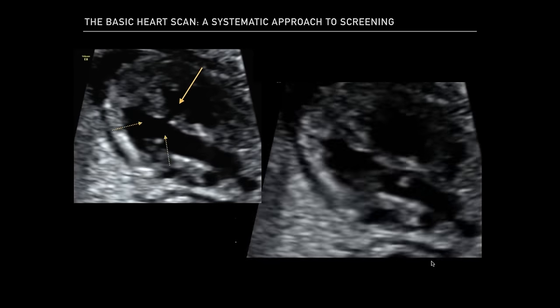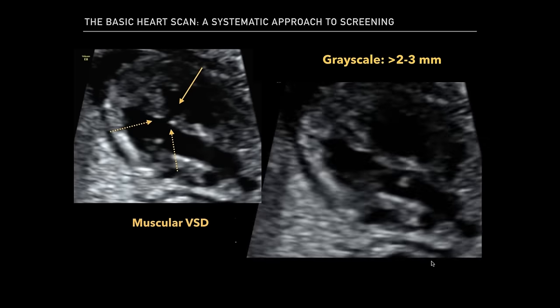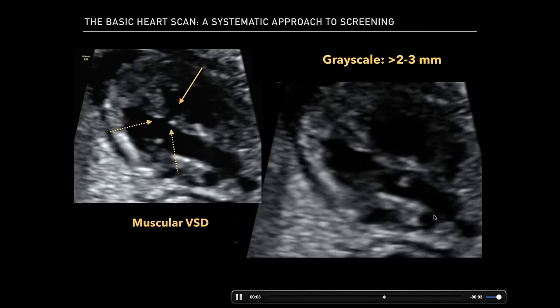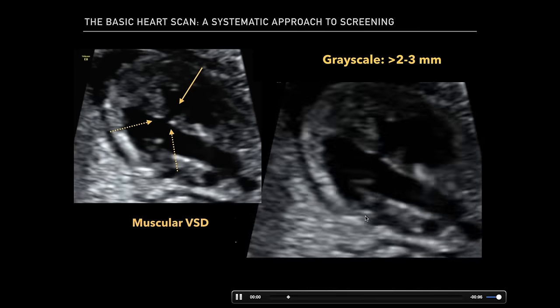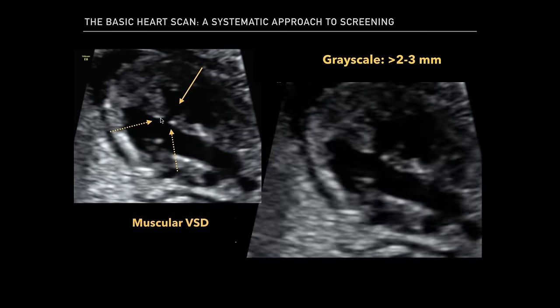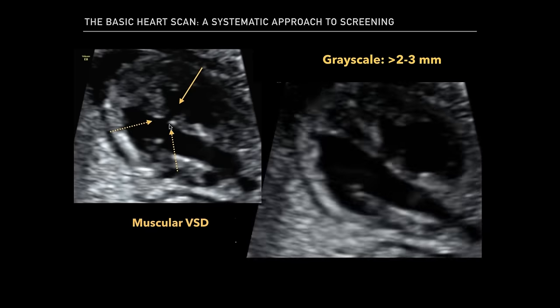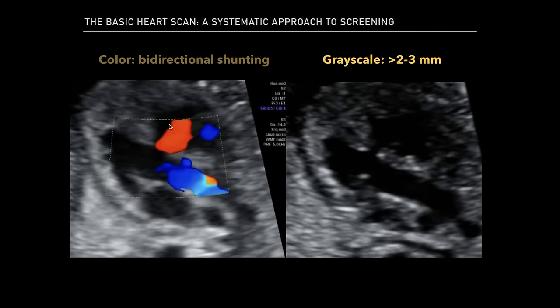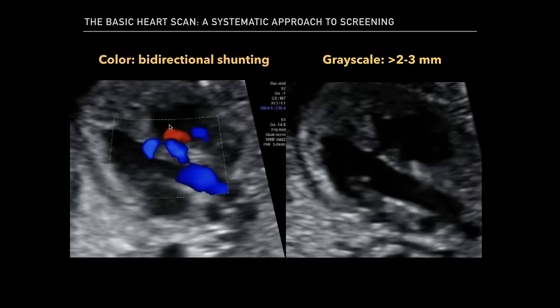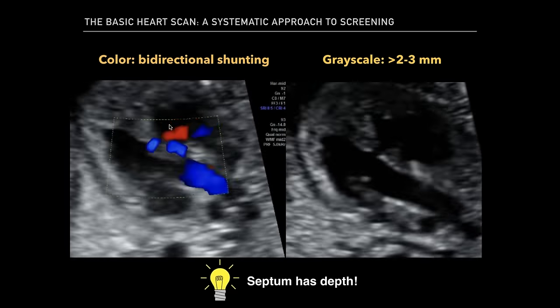Now here is just demonstrating that VSDs greater than 2 to 3 millimeters are visible on grayscale, as you can see here. And as you can see, we are not in the traditional septal view, but more looking into the left ventricular outflow tract view. Remember, the septum has depth and it has a curvilinear surface. And borders of the VSD commonly appear echogenic, as you can see here. This is an important hint to differentiating a true muscular VSD from an artifact. Now, that's another great tip. And of course, color just confirms the presence of the defect and the bidirectional shunting. Remember again, septum has depth.